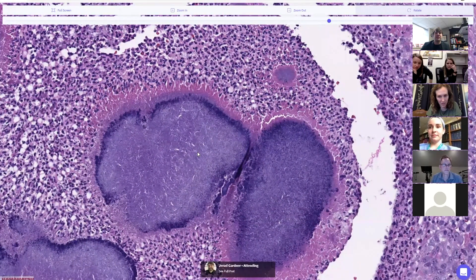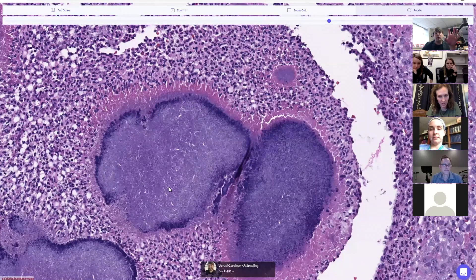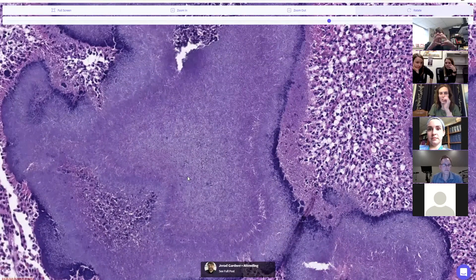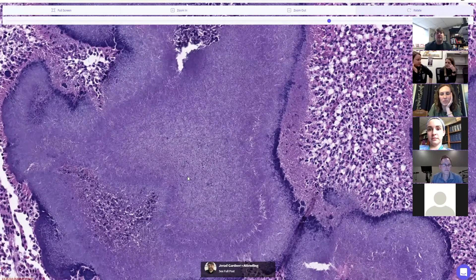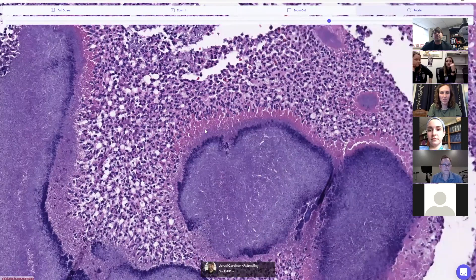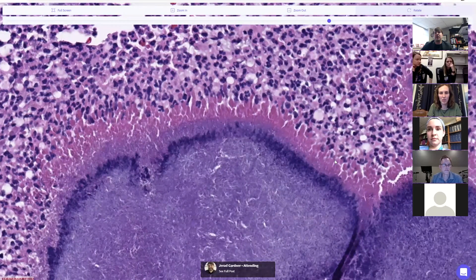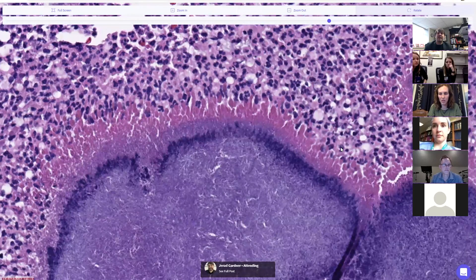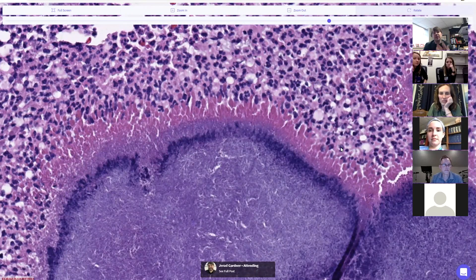This is a mycetoma — very good. This whole nodule, this whole ball, all these purple things are an aggregate, a big tangled mass of organisms. There are several different things that can cause a clumped collection of organisms. Note the beautiful layer around the outside of the fungal ball — like flames or fire on the outside. That is the Splendore-Hoeppli phenomenon: antigen-antibody complexes aggregating to the edge of this ball of organisms.